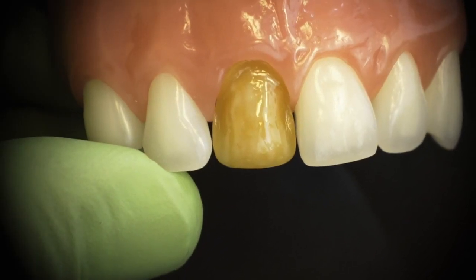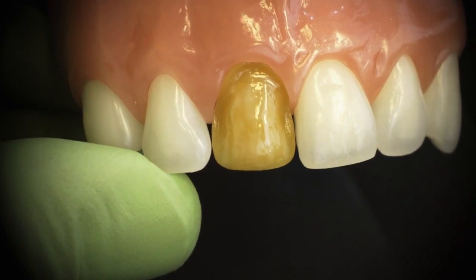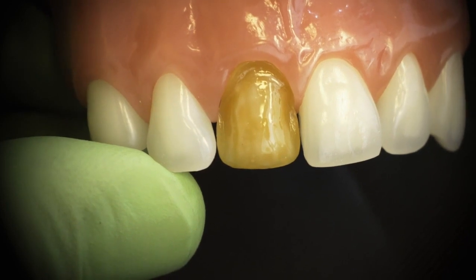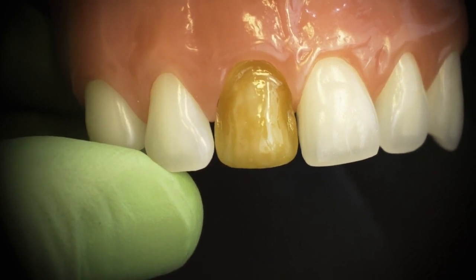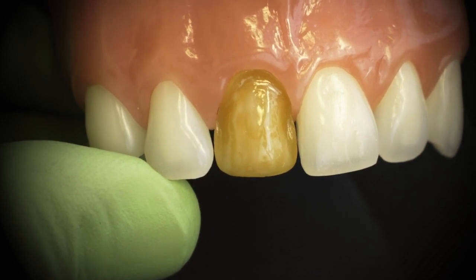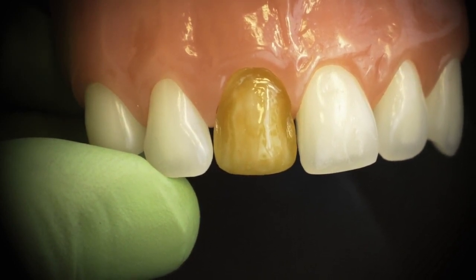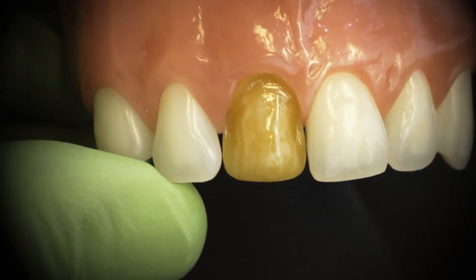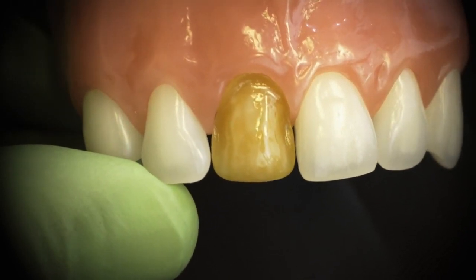Commonly, we're going to need to use additional layers of pink opaker, especially when we're using this dark of a tooth. Our goal is not to turn the tooth pink, but to raise the value or brighten the tooth, so our additional composites will help to continue to block out and bring the tooth to the Vita shade we're trying to create, which in this case is our Vita A1.